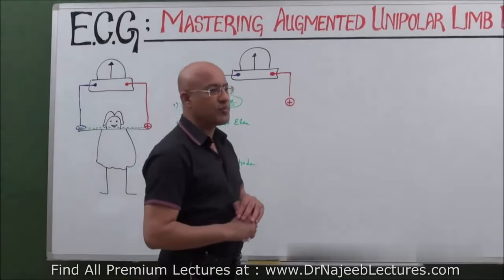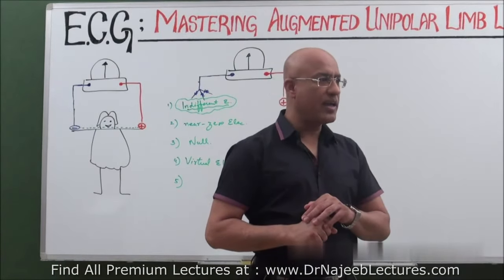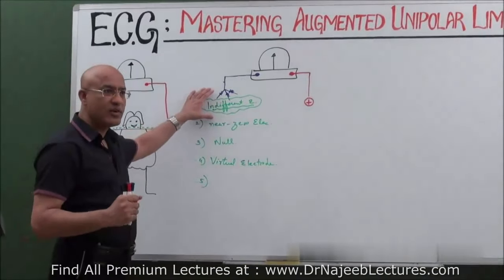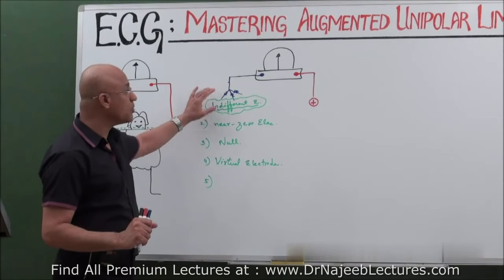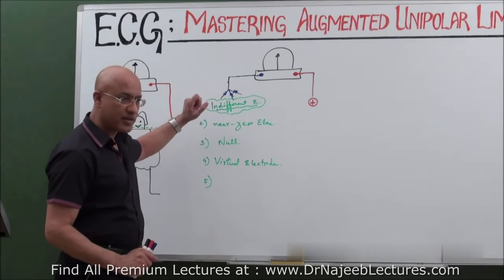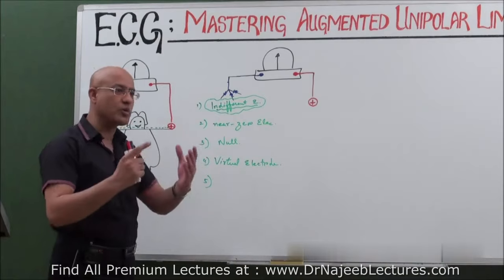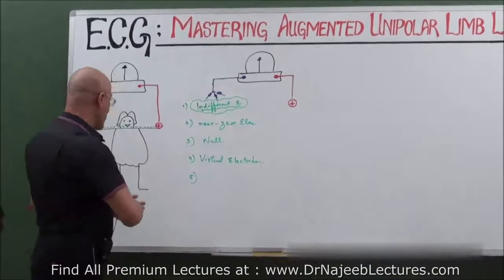Now our next concept is, why did someone make unipolar leads? Why in the past did some doctor put us into this trouble of learning this? Because some doctor was trying to make an indifferent electrode. Why is this electrode made? What is this electrode? What are the advantages and disadvantages of this electrode? Now we are going to learn why this indifferent electrode is made. Is that right? Let's go.